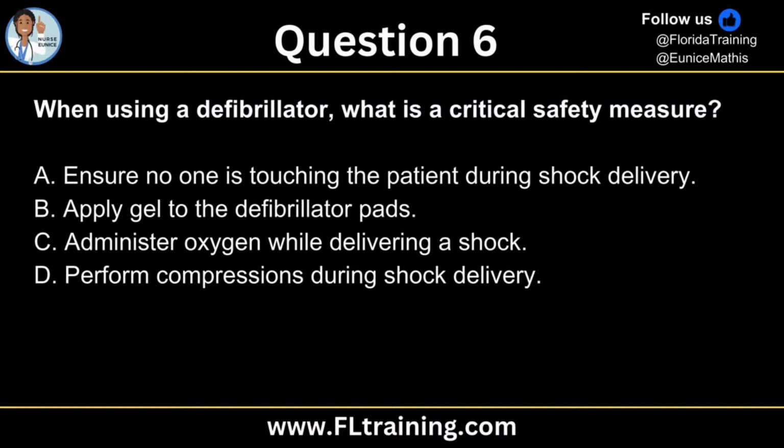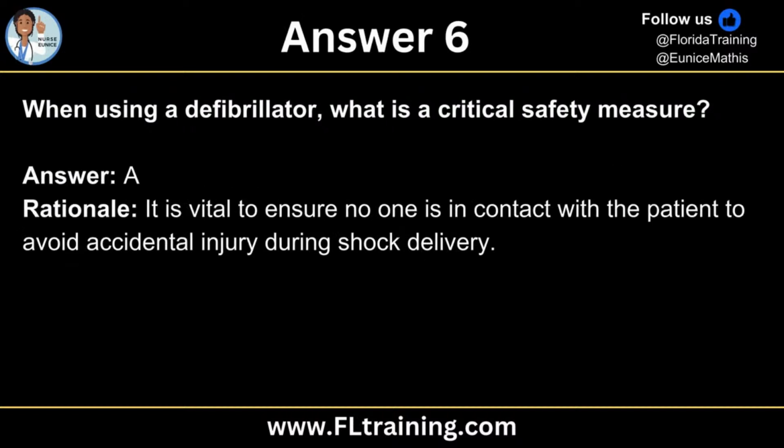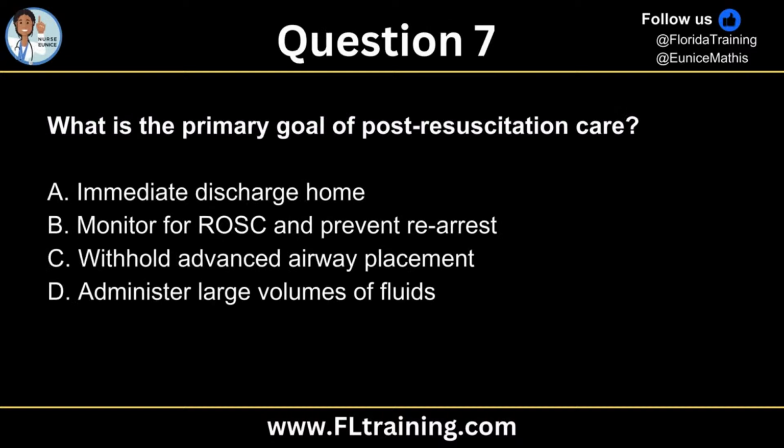What is a critical safety measure? We have to keep our teammates safe. So revealing the answer in 3, 2, and yes, you have it. It is A. We're going to ensure that no one is touching. That way we don't accidentally injure our coworkers or ourselves during shock delivery.